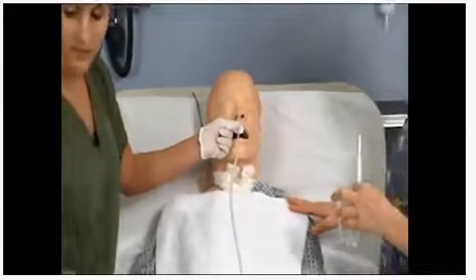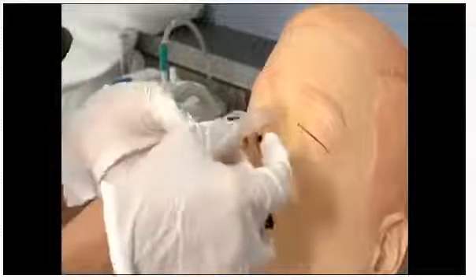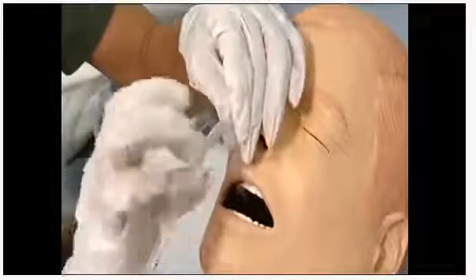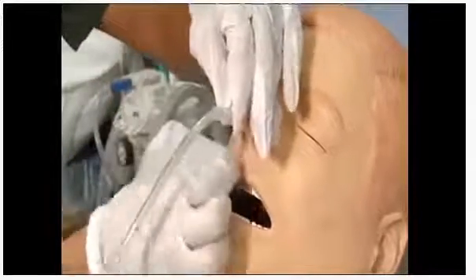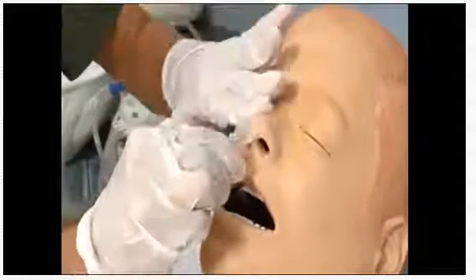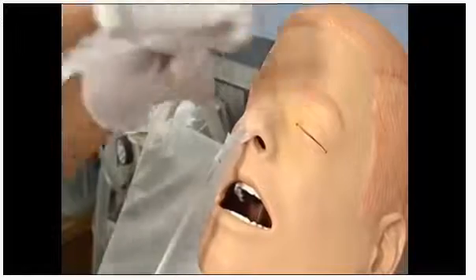This is when you're going to need to get the piece of tape that you made a split on. Put the top part that doesn't have a split onto the nose. And then you're going to get just one at a time. And I know this may be a little bit difficult with your gloves on. And just wrap one of them around. And then get the other piece and wrap the other one all the way around because you want to secure it. You okay, Mrs. Jones? All right. At this time, if I needed to, I'm going to go ahead and put another piece of tape right across, again, just to secure it.